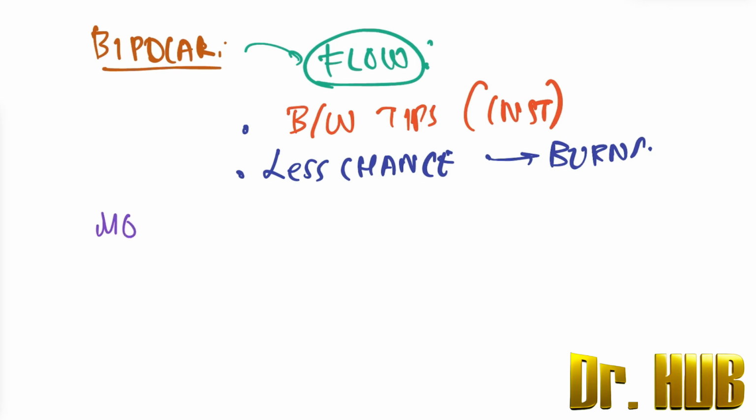Now let's look at the modes. When we look at the modes, there is only coagulation.